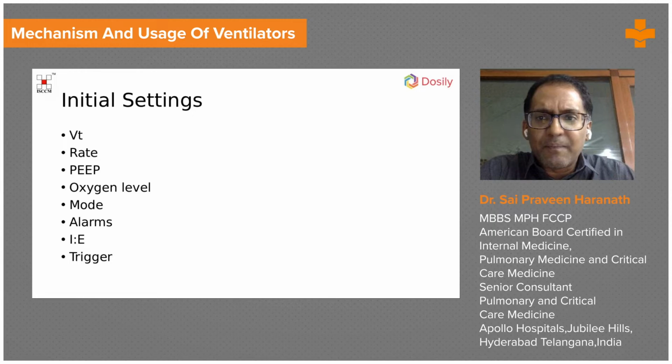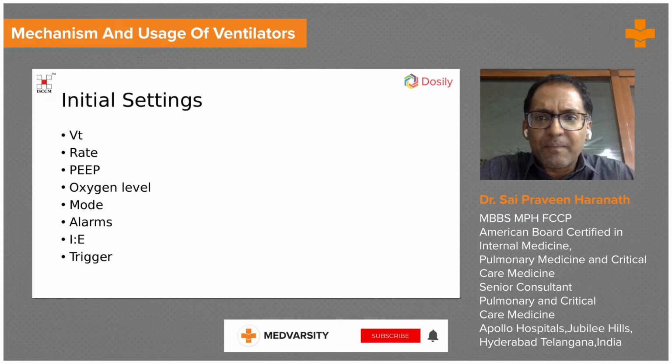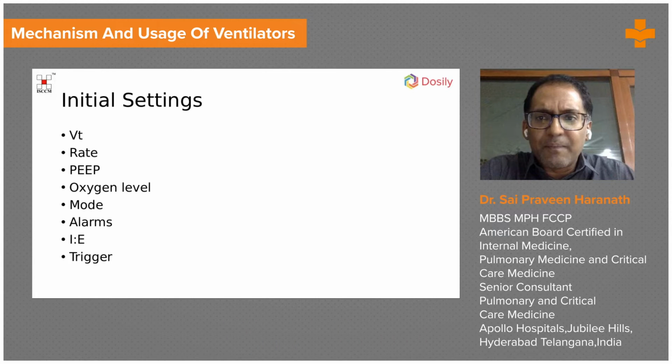It is how many times you breathe a minute. Each breath is divided. Say you breathe 20 times a minute. One minute has 60 seconds. So if you're breathing 20 times a minute, then you have a 3-second breath. And as you have a 3-second breath, you're going to be determining how much is inhalation and how much is exhalation. So inhalation to exhalation can be 1:2.